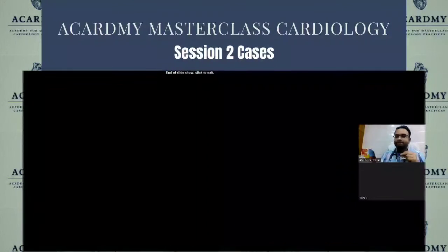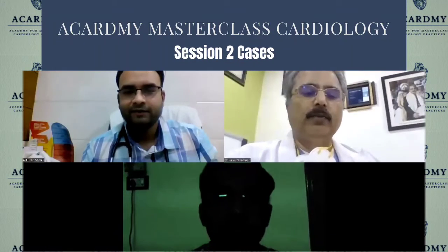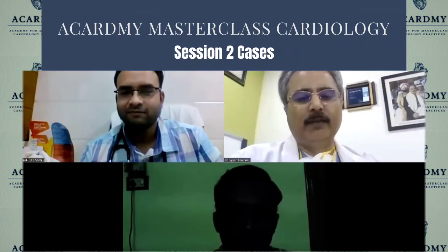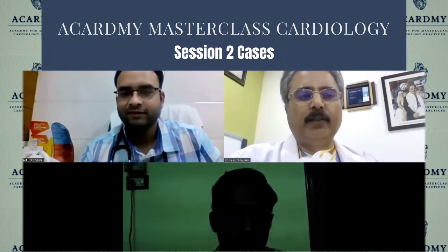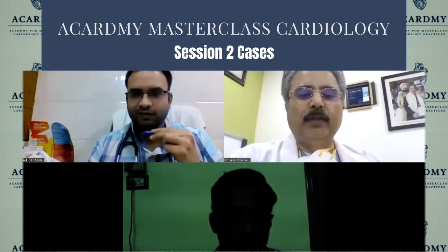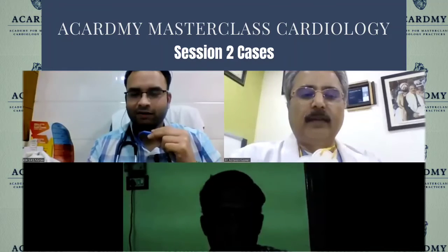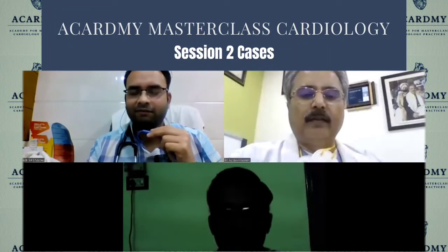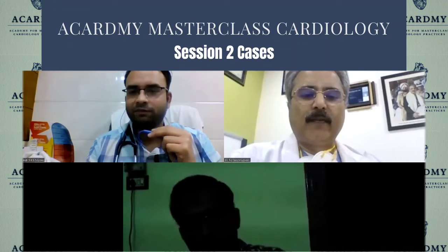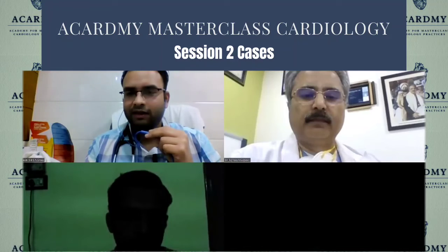Thanks, Ashish. So this was a wonderful case actually, and you had the fireworks in between also, while you lost both the wires. And by the time I think you had crushed one stent, so it was the worst time to lose the wires after having the first crush. Yes, sir, you are right, absolutely, and that's why the patient developed hypotension, and we had to put him immediately on inotropic support. We were lucky enough to rewire both the vessels without much difficulty.